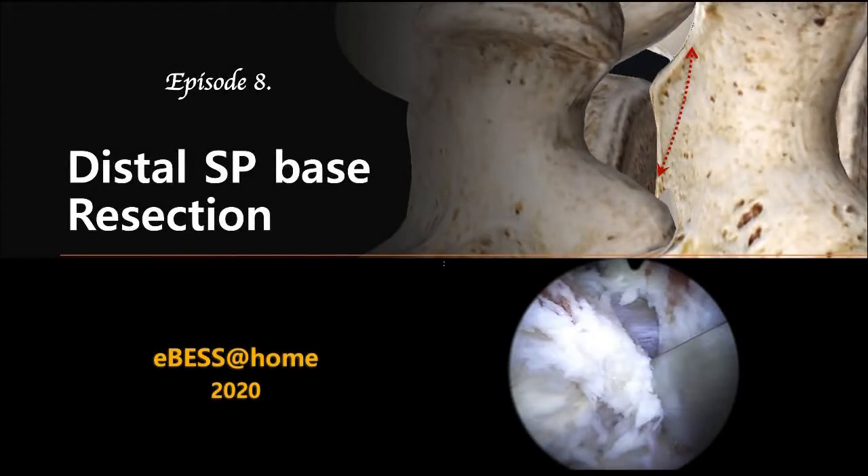Hi, Biportal New Surgeons. Are you ready to reach the contralateral side? In this topic, we are talking about distal SP base resection. This step solved the problem of narrow working space and difficulty of decompressing the distal traversing route on the contralateral side.